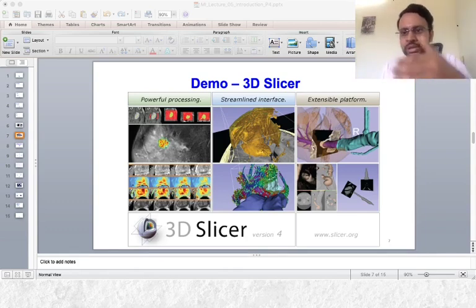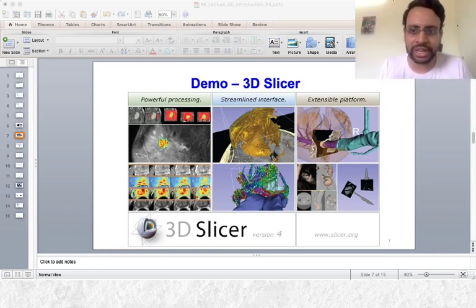For example, thresholding, there are various filters for doing thresholding based segmentation, edge detection, and then intensity mappings. You want to find out the gradients, then second order derivatives, neighborhood filters, smoothing filters, blurring based filters, edge preserving smoothing you want to do, and a lot of things.